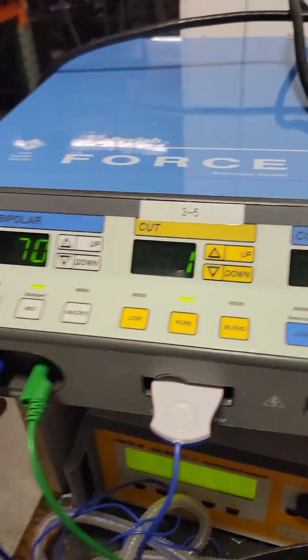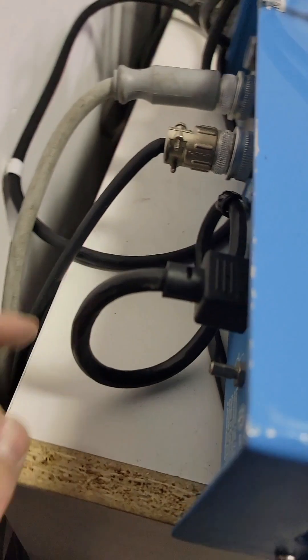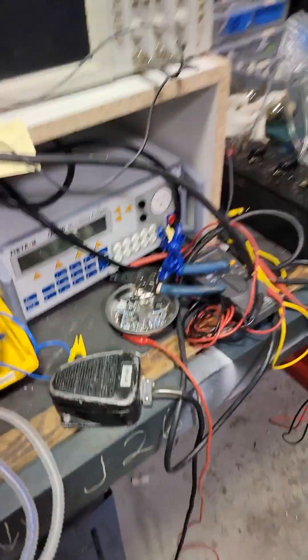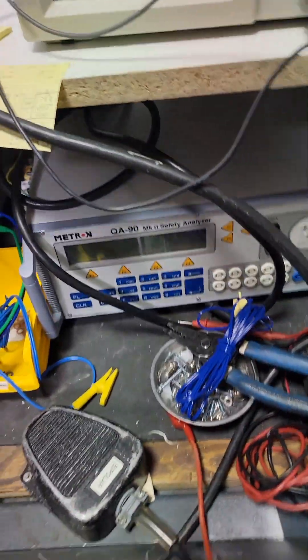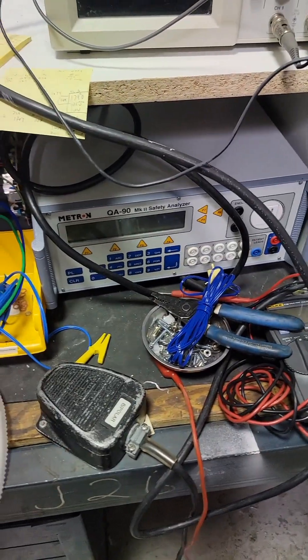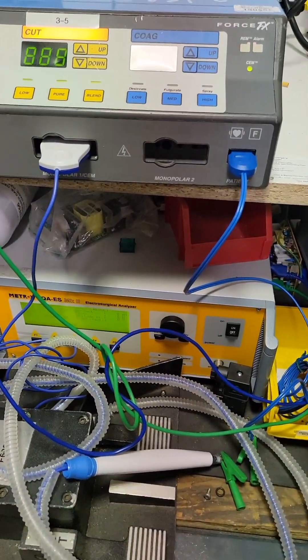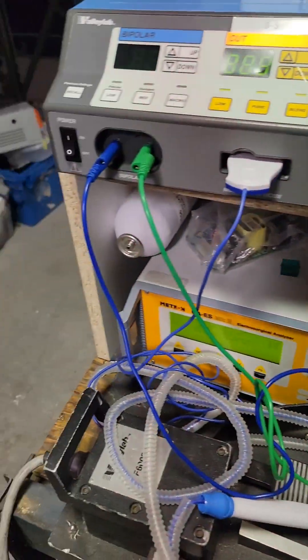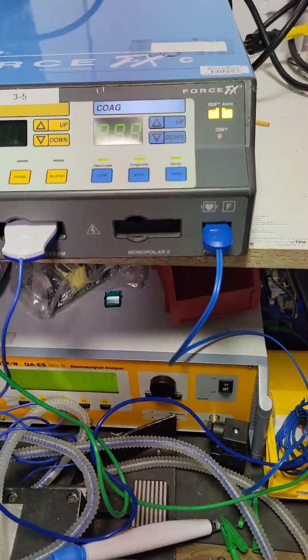First we'll start with bipolar. First thing: power cord, electrical safety. If you have a safety meter — I've got a Metron MK2 safety analyzer. If you've got a little portable unit, you check ground resistance, check leakage. At this point you should know how to do electrical safety. I'm not going to get into that — I'm going to do another video for electrical safety, but if you don't know how to do electrical safety, you are in the wrong field.